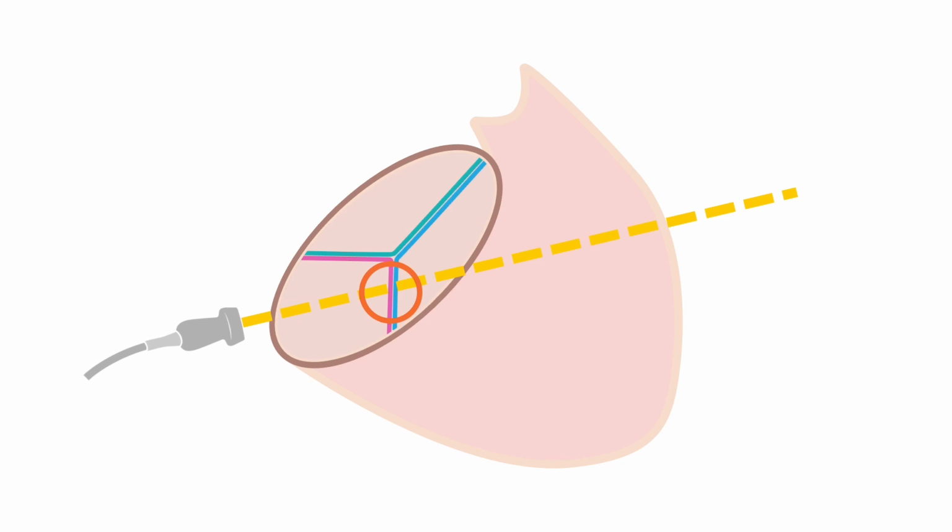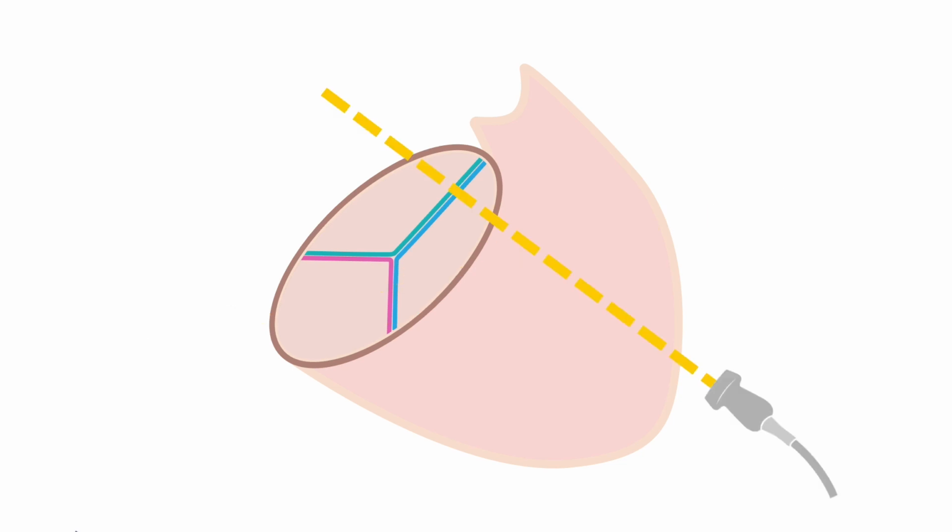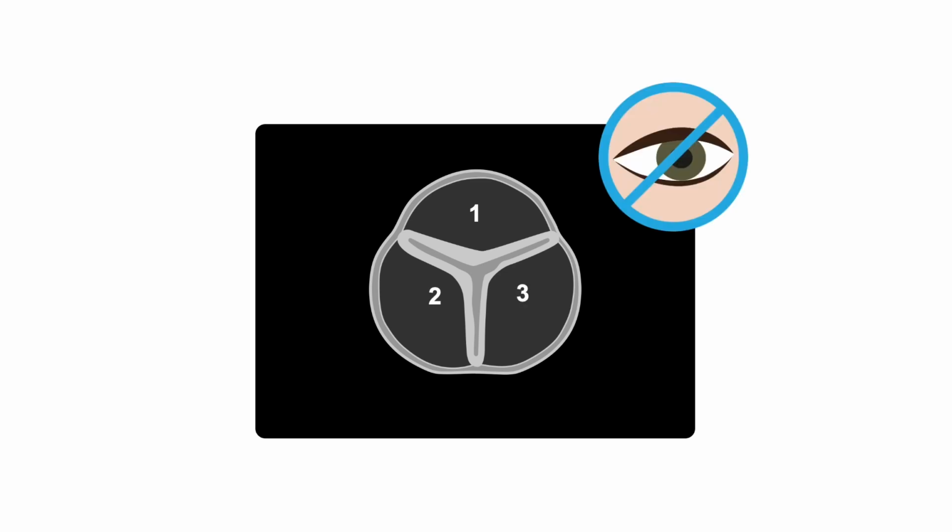One last try. This time a completely different perspective. Same issue. In this view, again, we can only see the anterior and septal leaflets. Although the leaflet proportions are now more realistic here, we can still only see 2. So, regardless of probe position, at any one time we can only see 2 of the 3 leaflets. Due to limitations of the technology, we can never see the tricuspid valve in full in an echocardiogram.